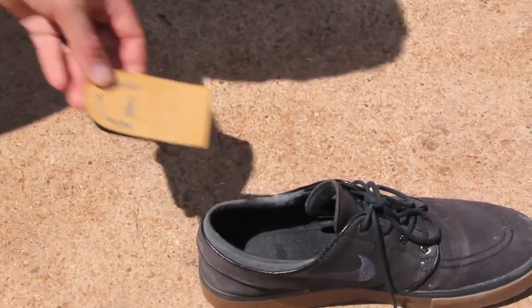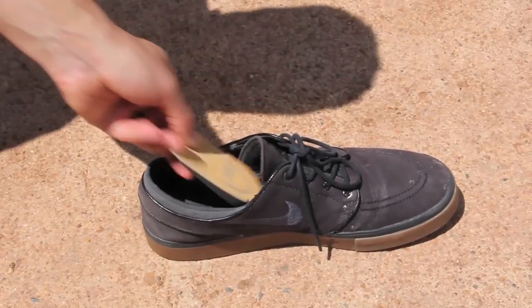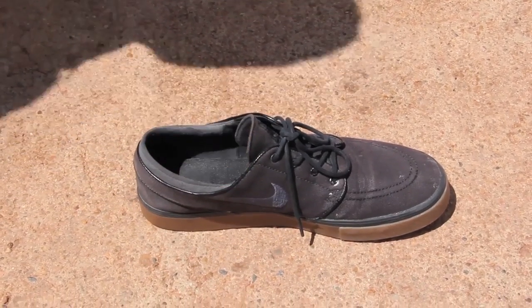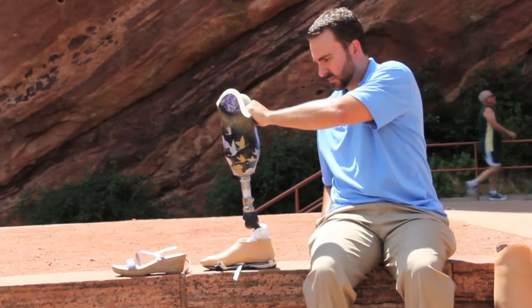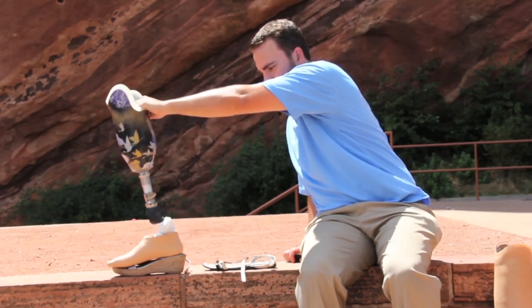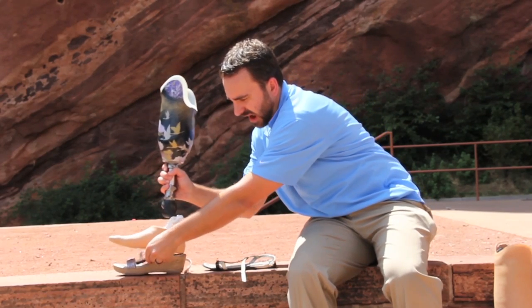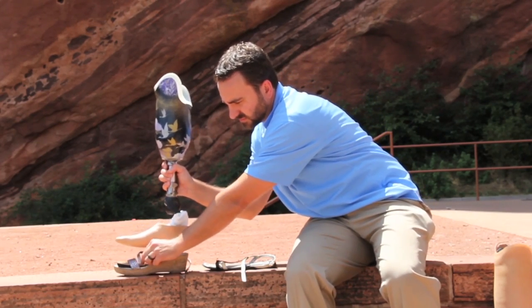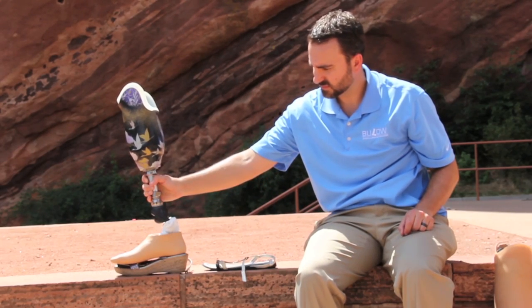When the prosthesis is aligned for a lower heel height shoe and you want to wear a higher shoe, a wedge can be placed inside the front part of the shoe. In this scenario, the height of the prosthesis remains the same. In the opposite situation, when a prosthesis is aligned for a higher heel height shoe and you want to wear a lower heel height shoe, a wedge can be placed in the back of the shoe.